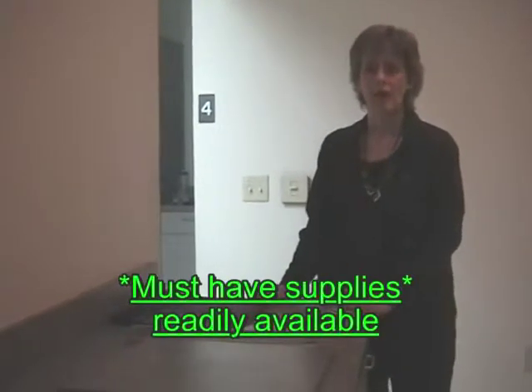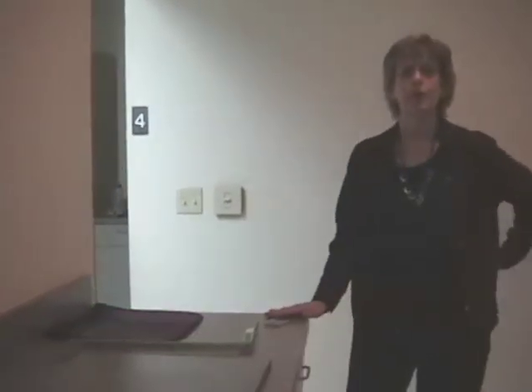Okay? Now we're going to talk about our patient. Our patient is, let's say, in the waiting room and they're in street clothes and we need to get them dressed. There's some communication issues that you do want to address with the patient. So we're just going to show you now. We're going to call our patient in. And I have a requisition in front of me that has the patient's name, identification information, and it says chest x-ray. I'm going to go to the waiting room.